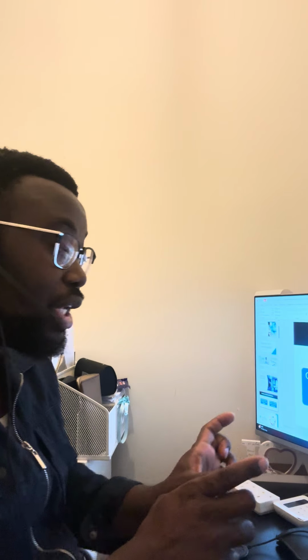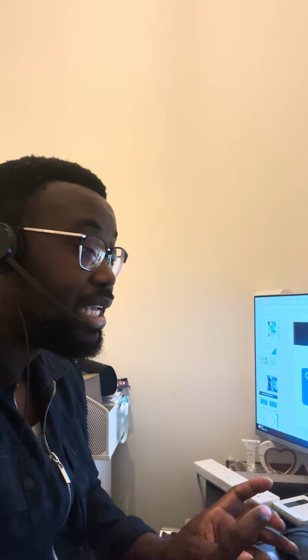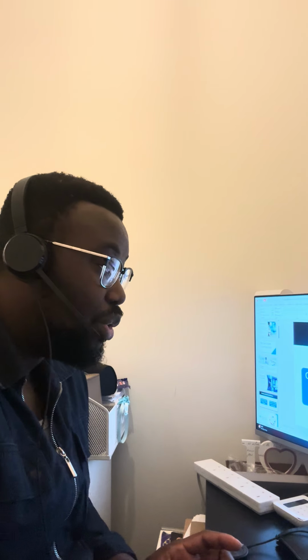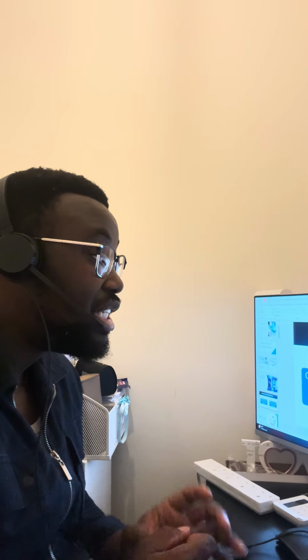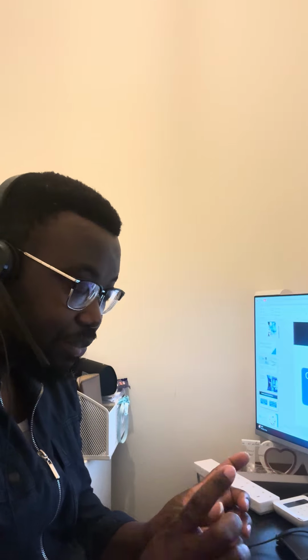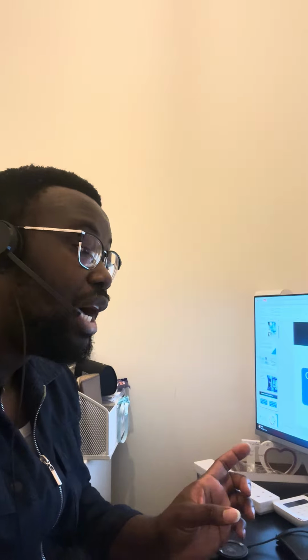So we said that in the evolution, we have the conventional denture production, and then we have the hybrid denture production, which combines the digital and the conventional, and then we have the full digital denture production. So the shift in workflow efficiency and accuracy is what we represent by this shift. You can see the workflow efficiency and the workflow accuracy.